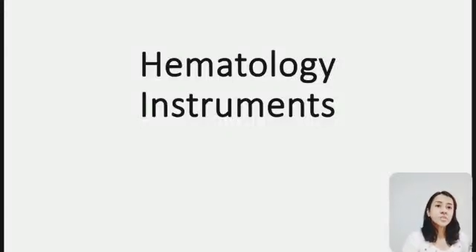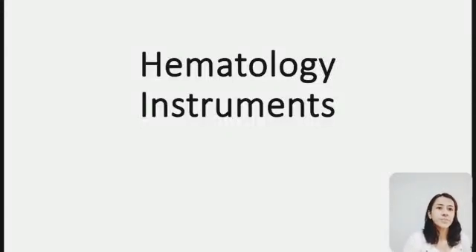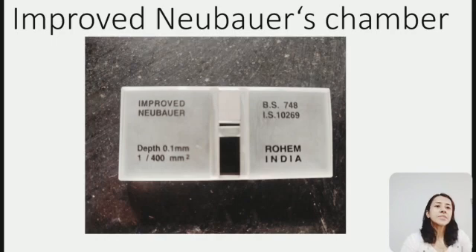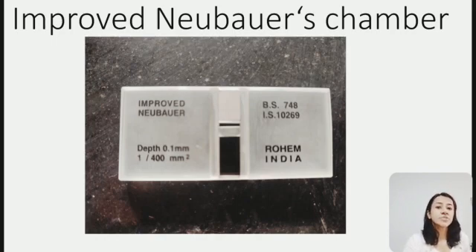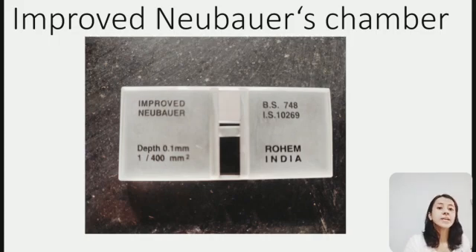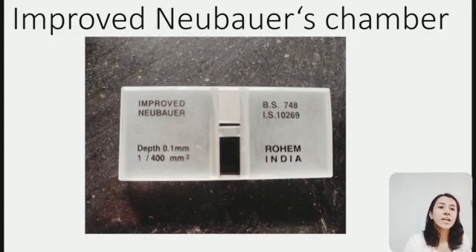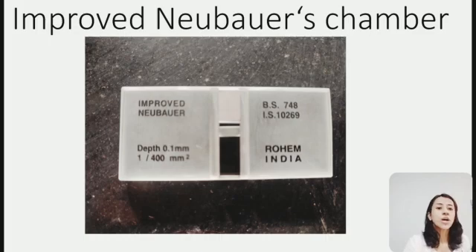Hello everyone, today we will discuss hematology instruments starting with the improved Neubauer's chamber. This is an improved Neubauer's chamber which is a thick glass slide having RBC and WBC counting squares, so it is used for counting of RBCs and WBCs.